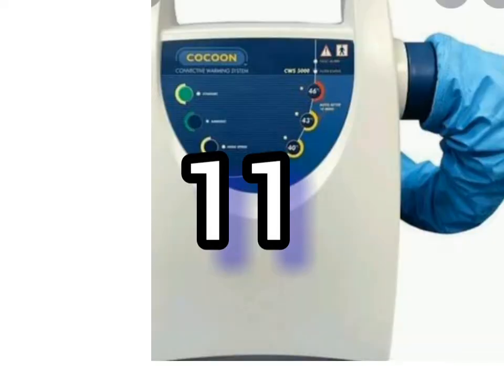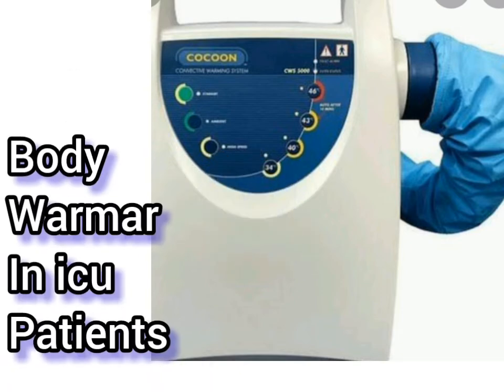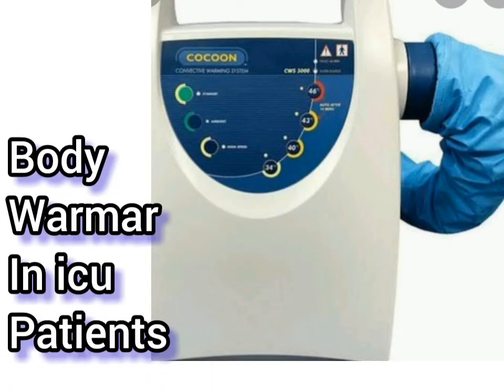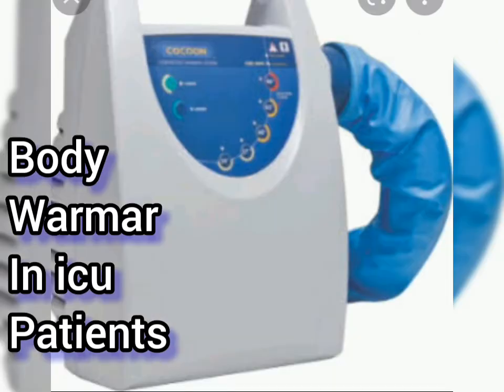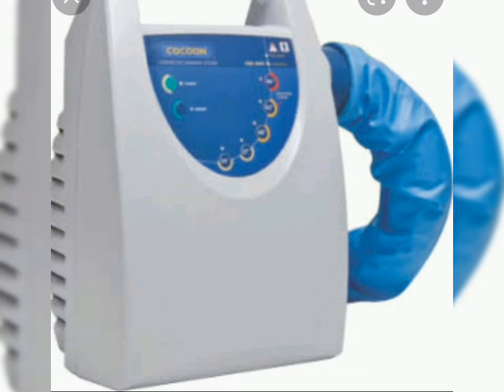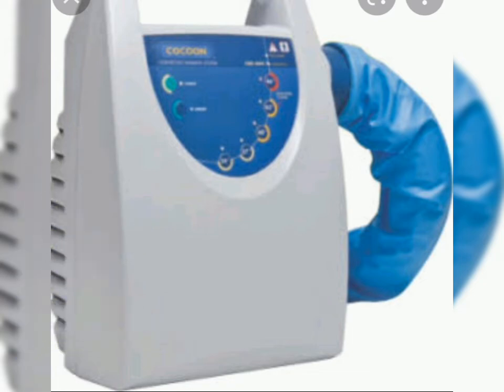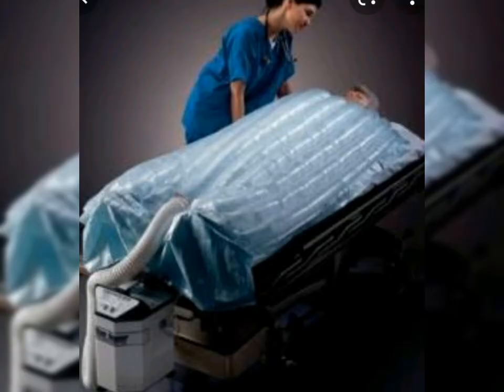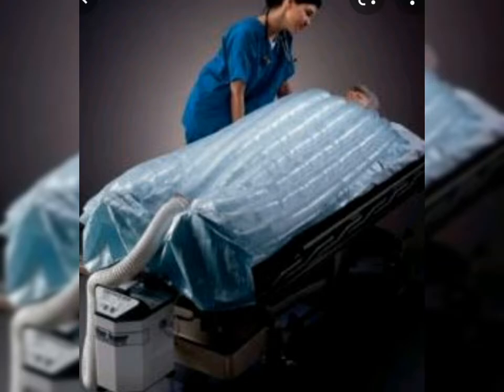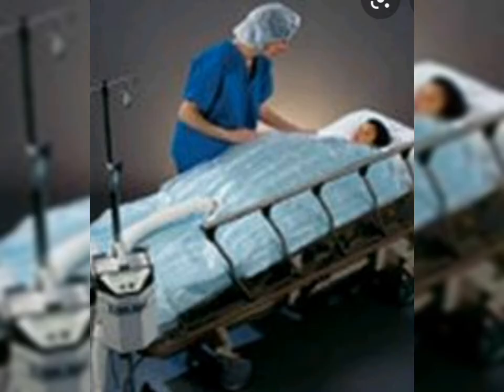Number eleven: the body warmer is most important. If a patient feels very cold or has hypothermia, the body warmer blanket is very helpful in warming the patient's body easily and effectively.